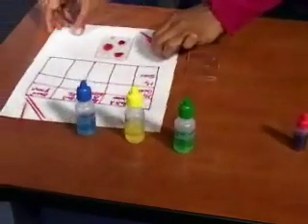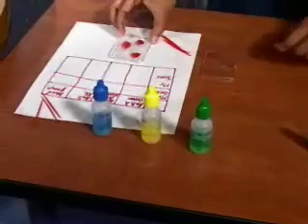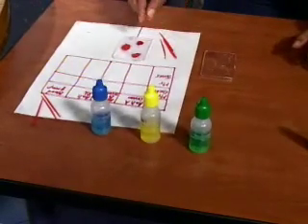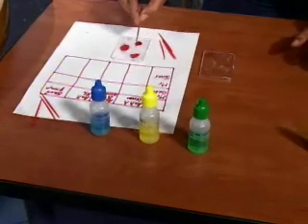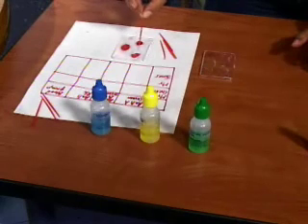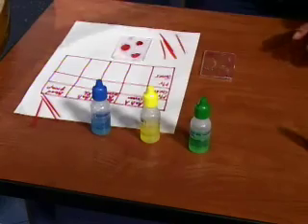Now if you look up here, all 3 appear clear. So in the first one, since there's no agglutination, we know we put anti-A serum, so it would only react if there was an A antigen. So since there is no agglutination, that means the A antigen is not present in the blood.